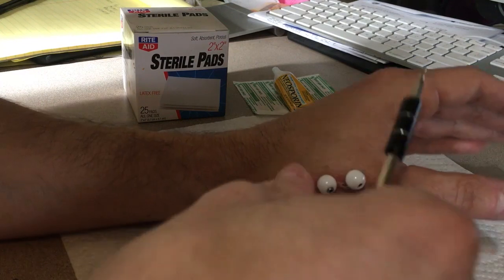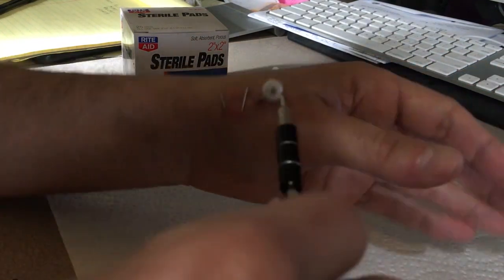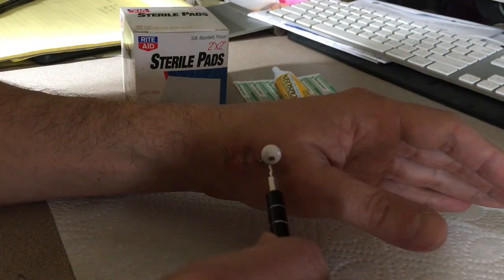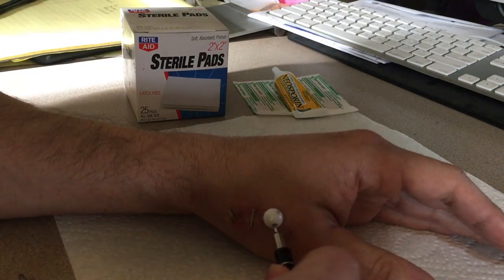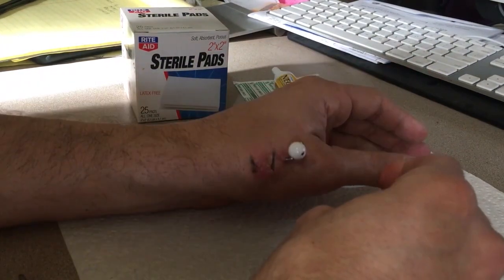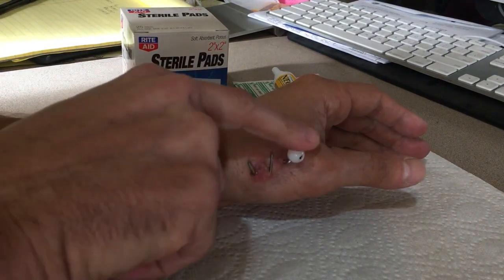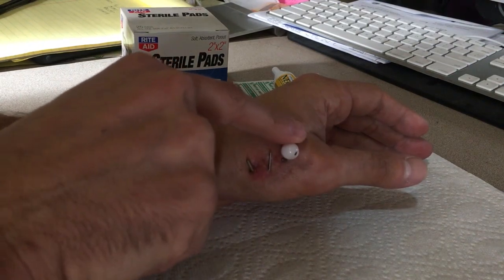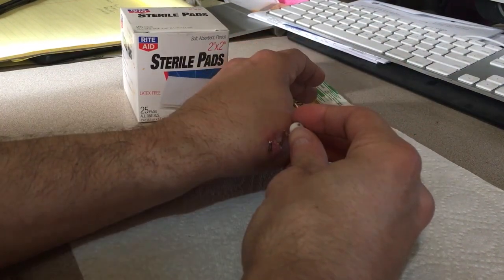Feels a little weird - something's moving around inside your hand there. I've cleaned up the area as best I could after taking off the cast. This one I think I can just pull out because it's already very loose, but what you want to do is break it away from the bone growth that has happened in the past few weeks.